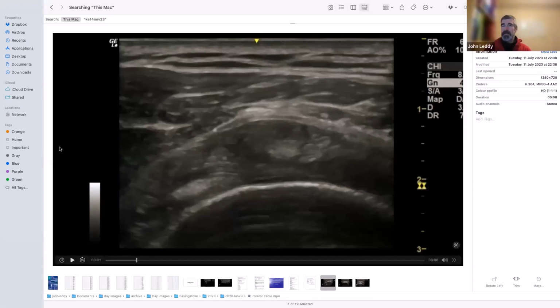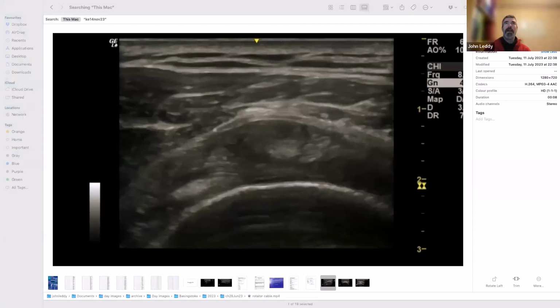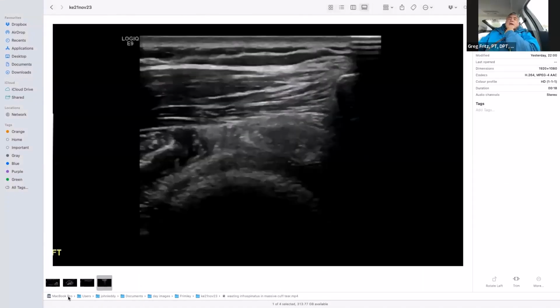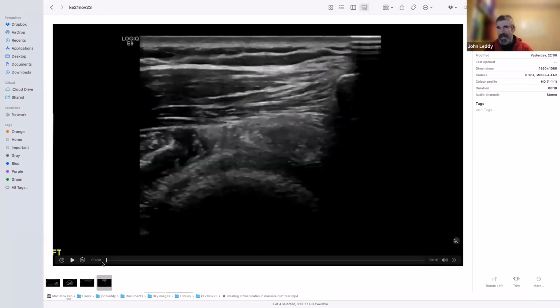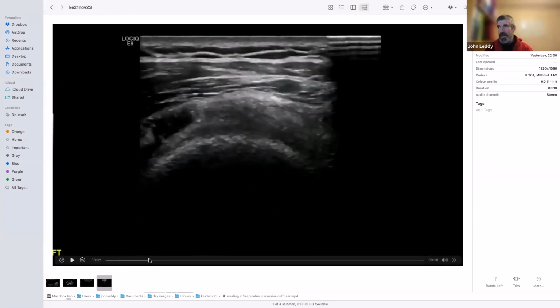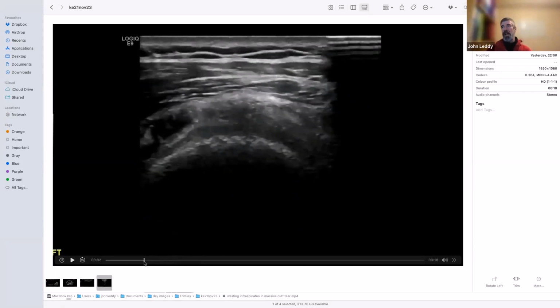All right, I want to have you wow me by the stuff that you wanted to share instead of me. Well, I'm just trying to pull up stuff that you won't have seen. It's nice to have rather than have to claw through. This is a bit of a ropey video, but this is something I look at.